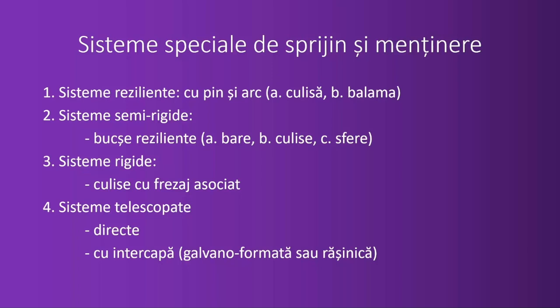And then there are telescopic systems, direct or indirect, having some gold galvanoformed intercoping. But if you use all this, you need more space. You need to prepare the teeth more.